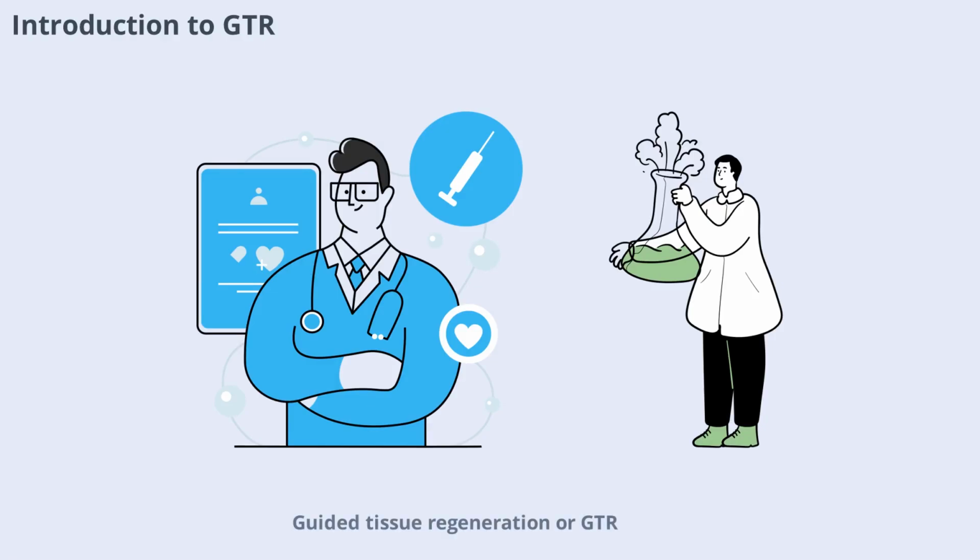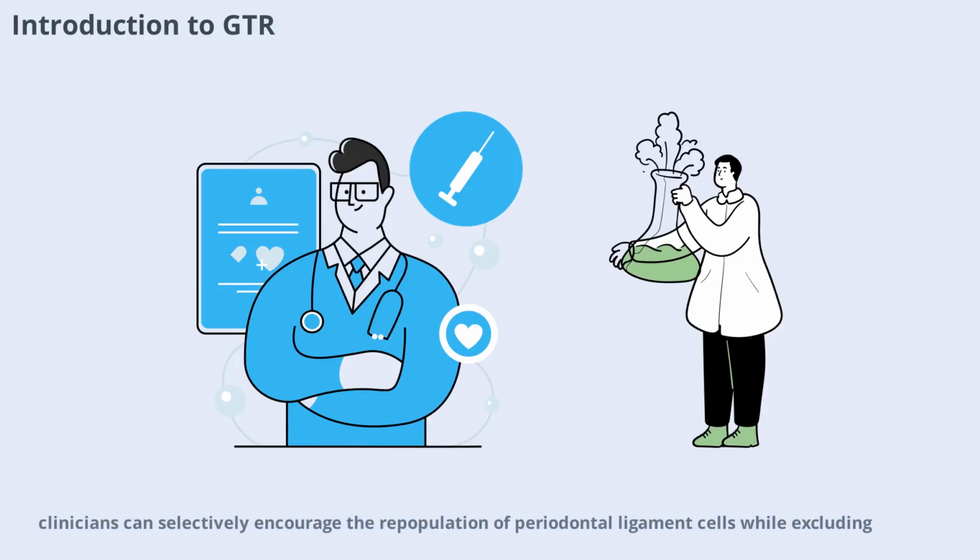Guided Tissue Regeneration, or GTR, is a revolutionary technique in periodontal therapy that focuses on regenerating the tissues lost due to periodontal disease. By using a barrier membrane, clinicians can selectively encourage the repopulation of periodontal ligament cells while excluding unwanted cell types like epithelium and gingival connective tissue from the defect area. This approach has transformed the way we manage periodontal defects, offering hope for restoring both function and aesthetics.